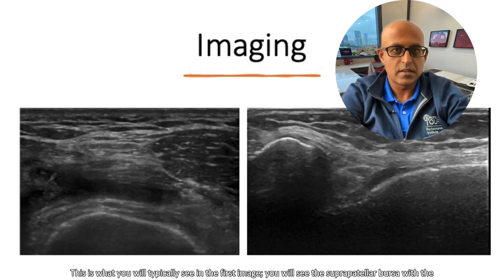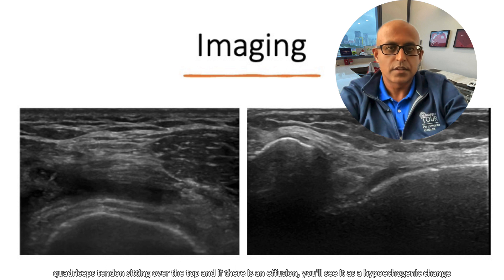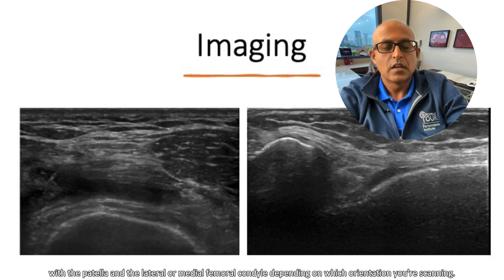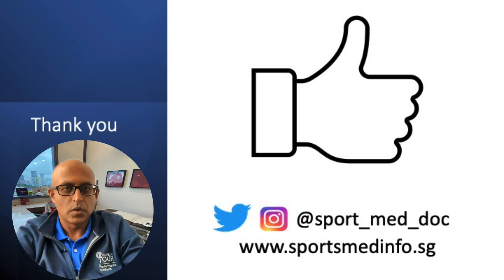And this is what you will typically see. In the first image, we will see the suprapatellar bursa with the quadriceps tendon sitting over the top. And if there is an effusion, you'll see it as a hypoechogenic change above the femur. Then in the second image, you see the patellofemoral joint with the patella and the lateral or medial femoral condyle, depending on which orientation you're scanning.